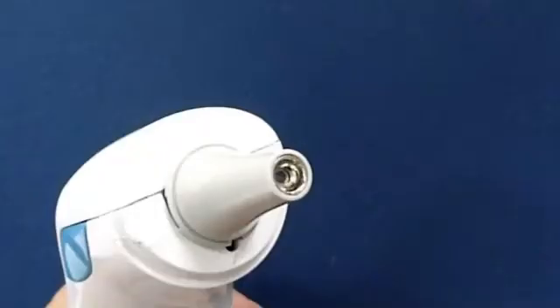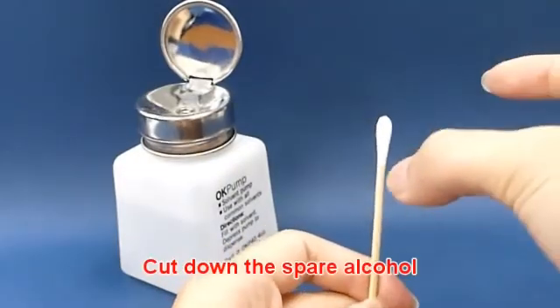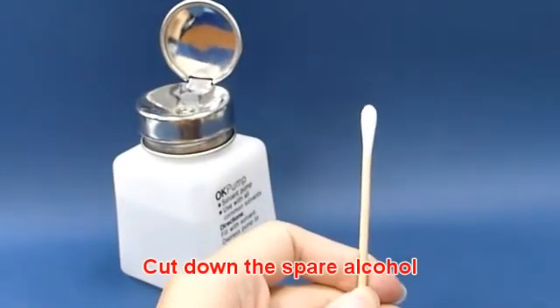To ensure accurate measurement and avoid cross contamination, clean the probe and probe lens after each use. Use a cotton swab with 70% concentration alcohol to clean the probe, and slightly flip the cotton swab to reduce excess alcohol.